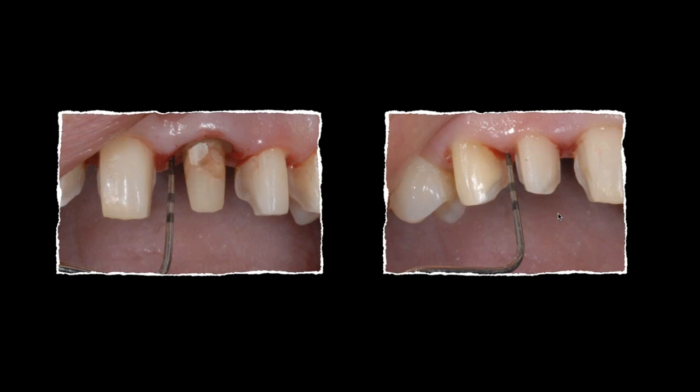And I'm sure most of you are already aware of this, but the ideal margin placement for the doctor is 3 millimeters from the crest of bone. And if the doctor follows that 3 millimeter marginal placement, well, that means all you need to do is measure 1.5 millimeters away from the margin. And then you'll always be at a 4.5 range. And I say 4.5 because I could be 4, I could be almost 5. That's going to be really more dependent on the type of tissue. But in the end, it at least gives you a point to work from. So what's the ideal world? Have your doctors prep their margins 3 millimeters from the bone and you'll be safe.